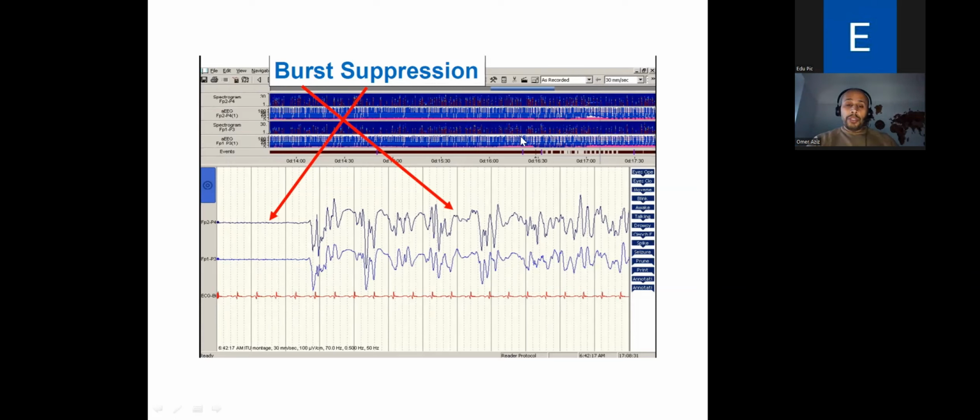For example, a patient comes in with status epilepticus. We intubate and ventilate them, we increase their sedation, keep on increasing their sedation, and they continue to seize. So we continue to increase their sedation and anti-epileptic medication until they get to the point of either burst suppression, where they're no longer having seizures, or to the point where their seizures are controlled. So one of the two. Burst suppression might be a therapeutic goal in a patient with difficult to control seizure activity, or if you want to completely suppress and rest the brain, or it might be a consequence of hypoxic ischemic injury or any other injury to the brain.